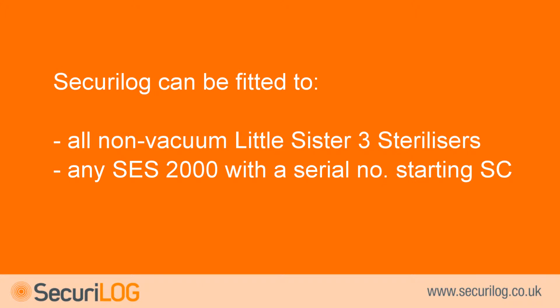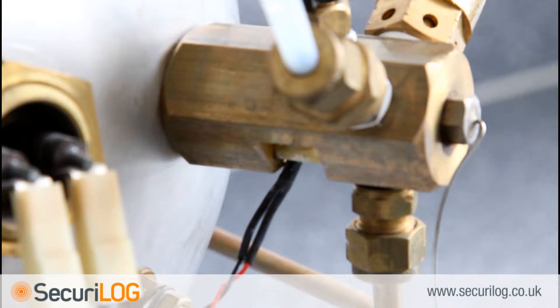Securilog can be fitted to all non-vacuum Little Sister 3 sterilisers, any SES-2000 with a serial number starting SC, and also the SES-2000 with a serial number starting SED.